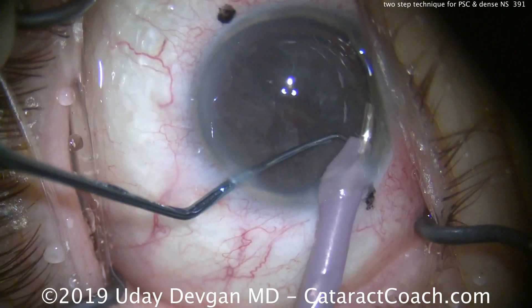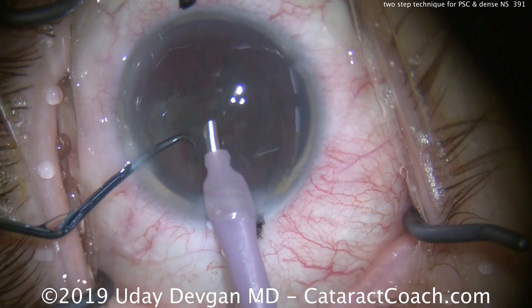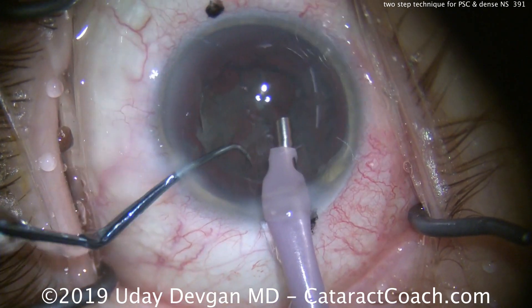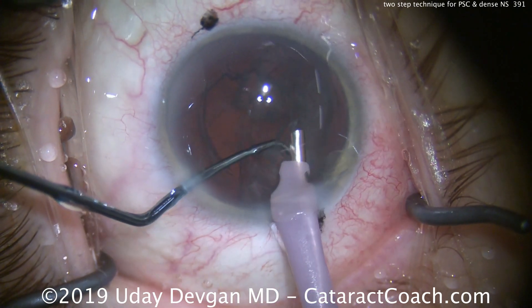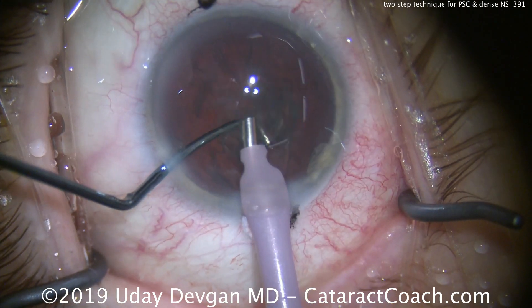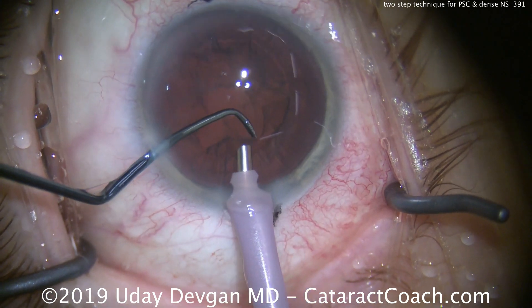Now we're going to aspirate out the shell, and the shell is going to contain the posterior plaque. Using the chopper to feed it and help it come out of the capsular bag, we bring this whole epinuclear shell out just like that. I use the same phaco settings, just modulating with my foot pedal control — no separate setting needed, just good surge control. And just like that, the epinuclear shell and the posterior plaque are gone.